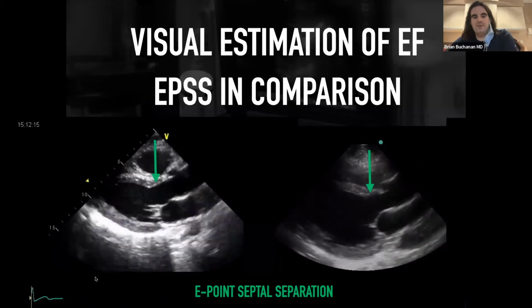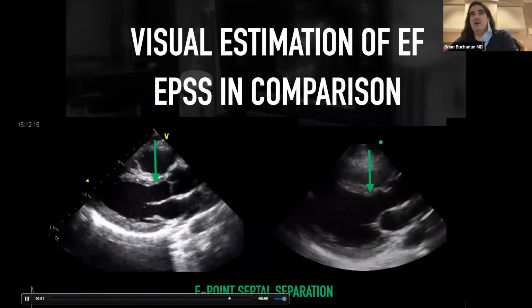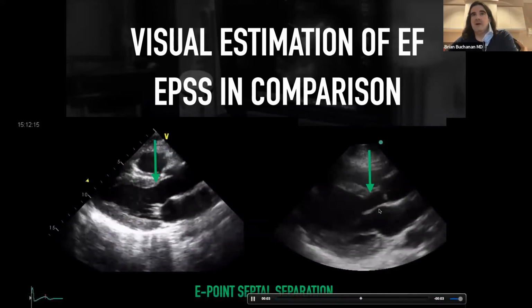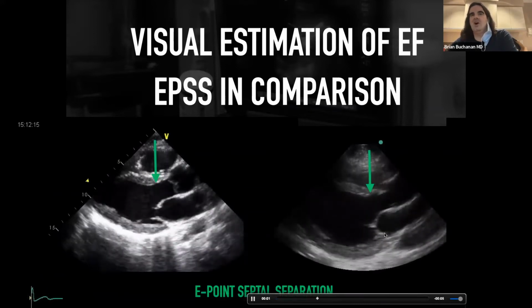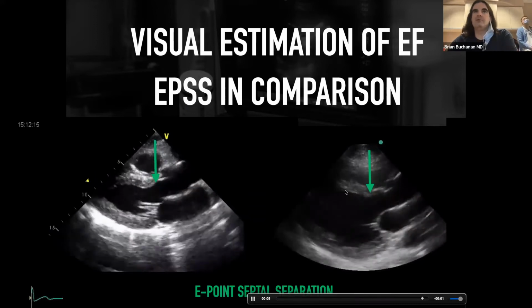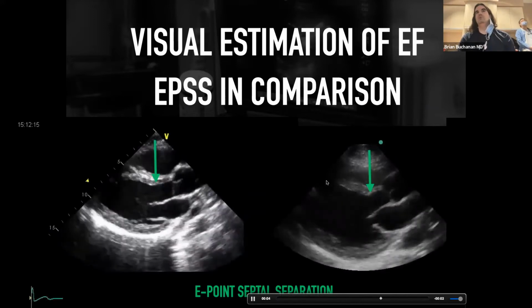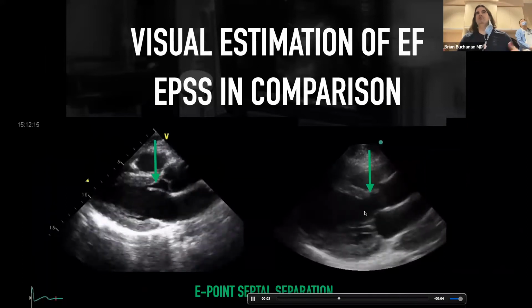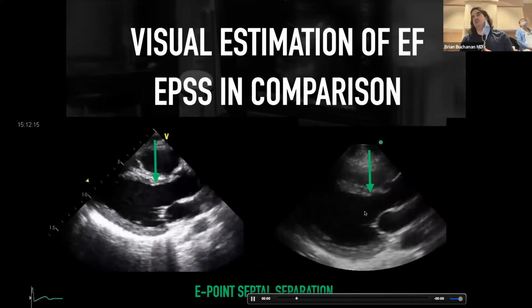Now, if your cardiac flow goes down because you have impaired function, then yes, you'll have a reduced excursion of that mitral valve. But it's a bit more complicated than that. What happens in a heart that undergoes this kind of disfiguration is that the papillary muscles apicalize. They actually go from, say, here to a little more apex-wise. They really tighten those chordae, and there's less movement. So the EPSS isn't all just about flow. It's also about the configuration of the ventricle itself.